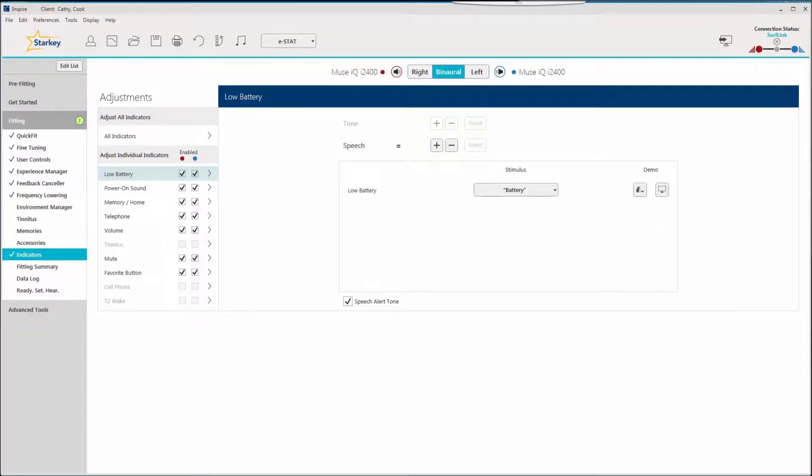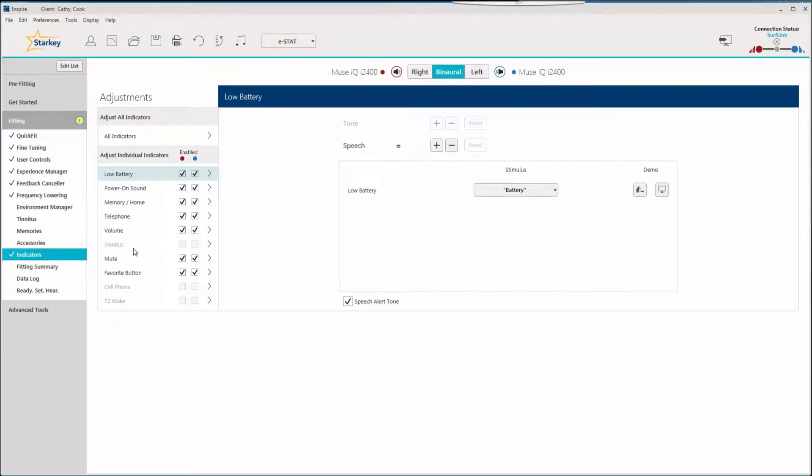Available indicators depend on the accessories enabled or how the user control has been set up. If an indicator is grayed out, the corresponding user control has not been enabled in the software.